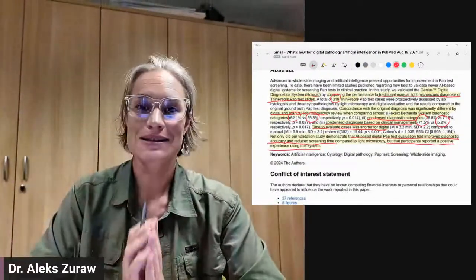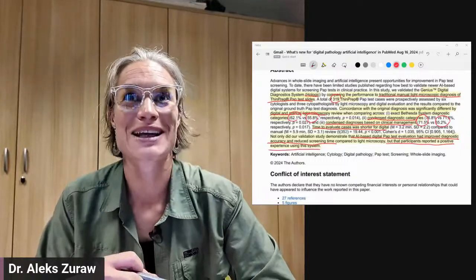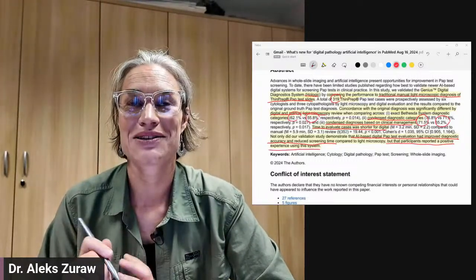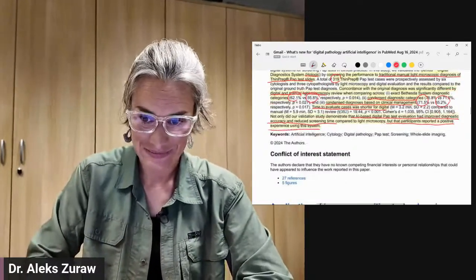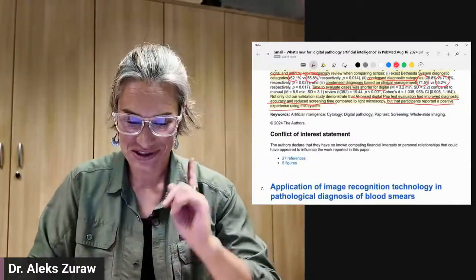Like, okay, let's say you have something that's super accurate that nobody wants to use. They will just defend themselves from using it. So the user interface, user friendliness of those digital tools is super important, and participants liked it. So this is fantastic. And I have follow-up comments about our language discussion.